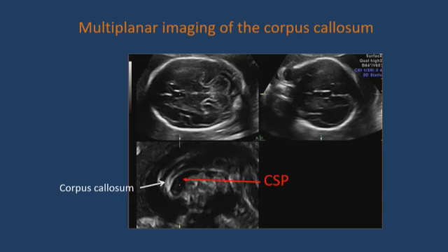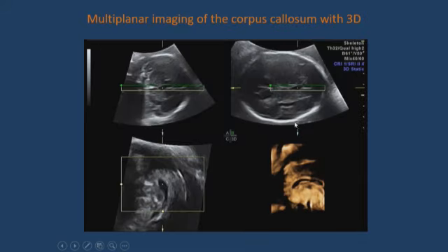It just does phenomenal in GYN, but it's not that helpful in OB right now. But this area, and then looking at the cleft lip, cleft palates, really is good. So we're going to make our box nice and small, but this is what we can do: we can assess that area of the cavum and the corpus callosum.